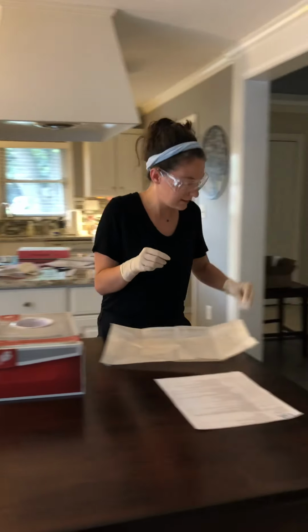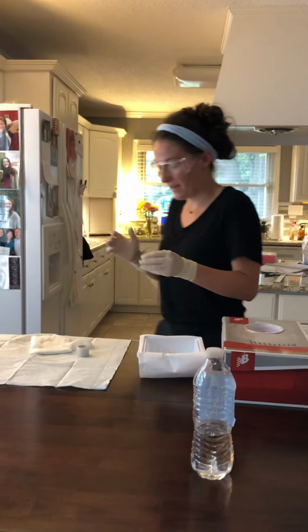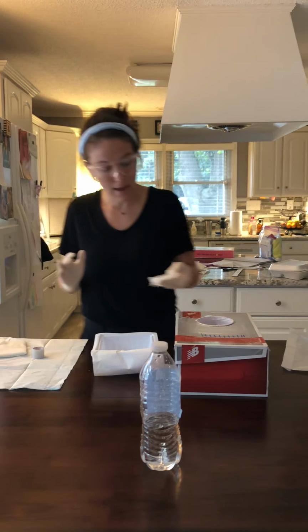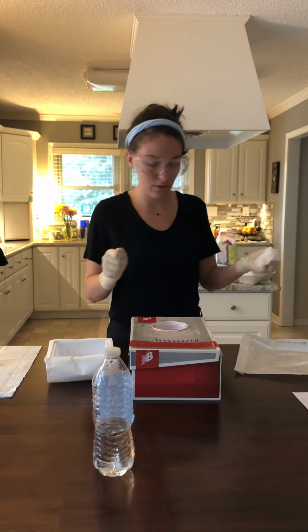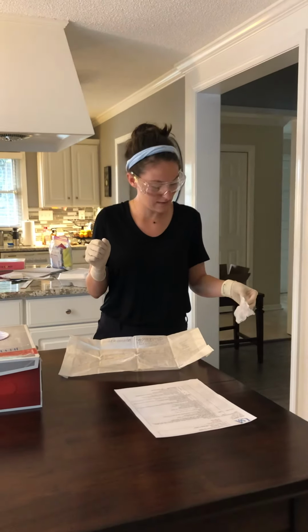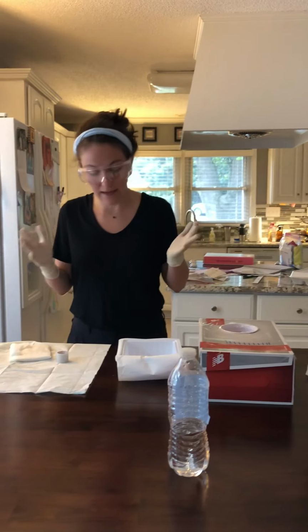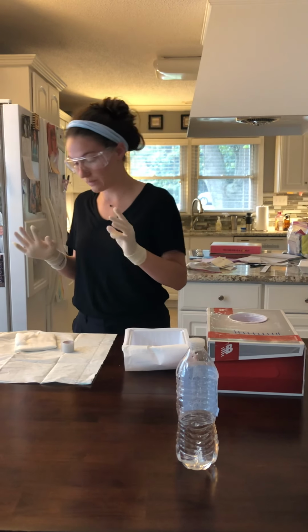All right, now I'm going to pat down the wound, pat the wound dry. I'm just going to go down the center of the wound. Great, so I've cleaned the incision line and it is still intact. And now I'm going to insert more gauze into the wound area.